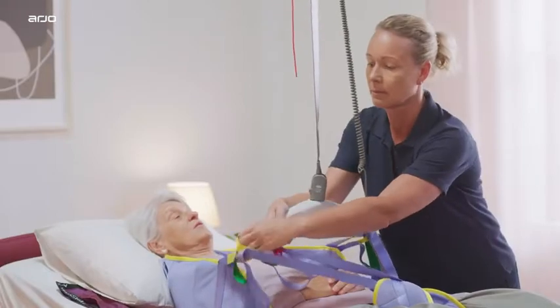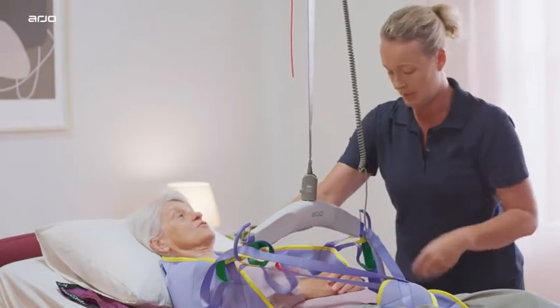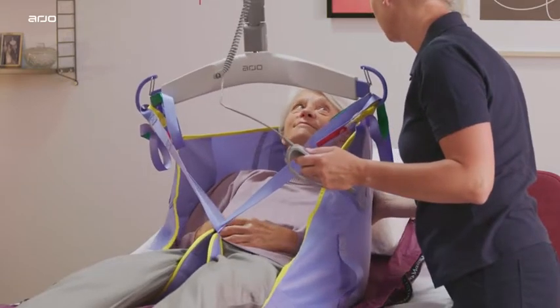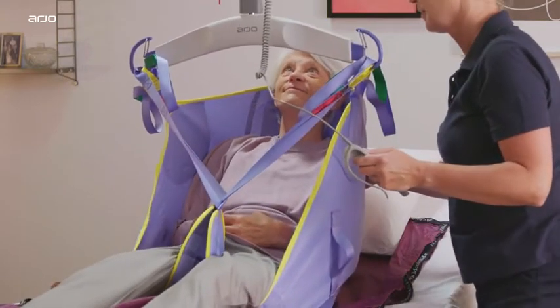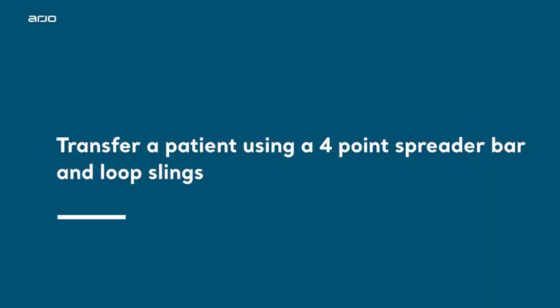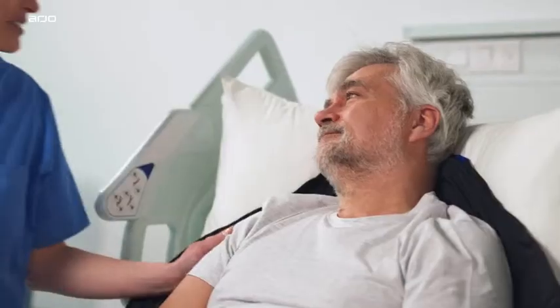Using different loops will place your patient or resident in a more or less upright position. Use shorter loops at the head and longer at the legs to place your patient or resident in a seated position. Transfer a patient using a 4-point spreader bar and loop slings.